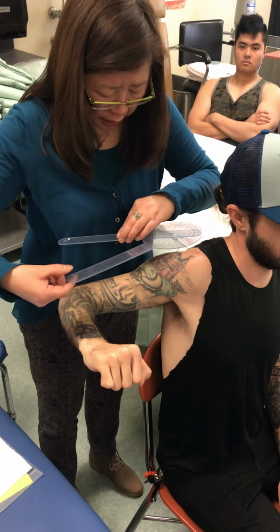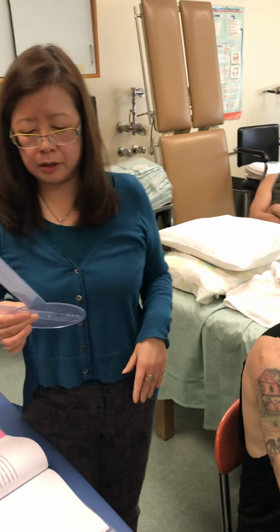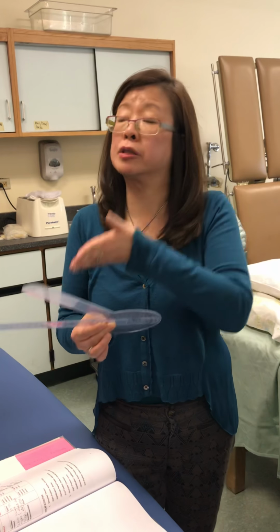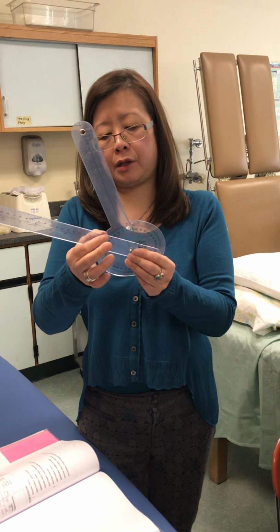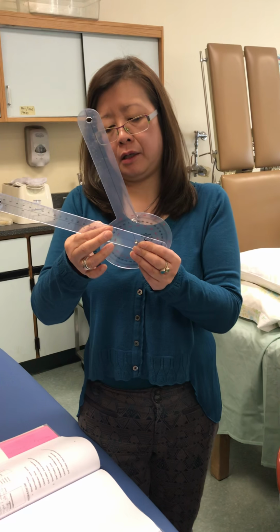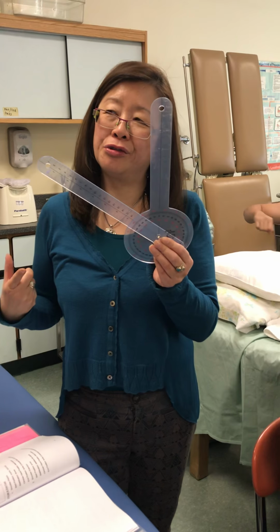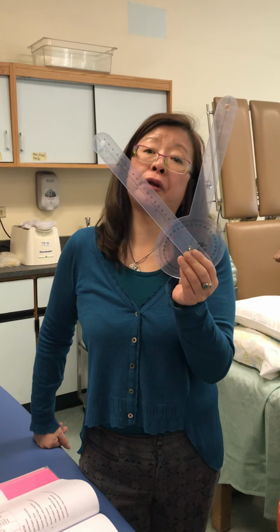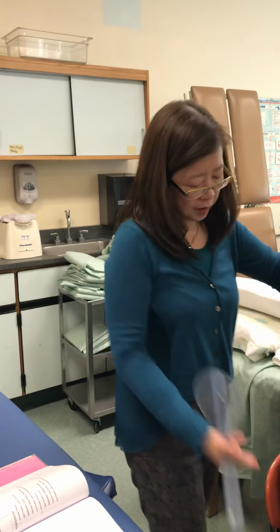Okay. Alrighty. So, holding it still. You okay? So he started at 90. Well, he started at 0 and went to 90 to 0. That's 90 degrees. He went past it. 10, 20, 30, 40. So what is that? 130. Oh, he has more actually. Sorry. He went to 39. 139. Does that make sense? Because he started at 90. Okay. I'll do it again.